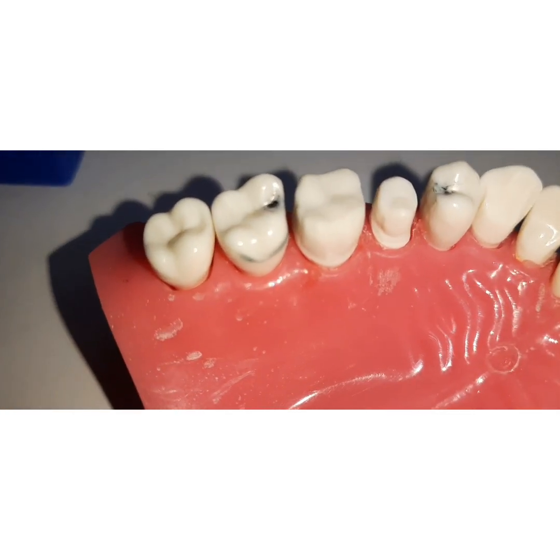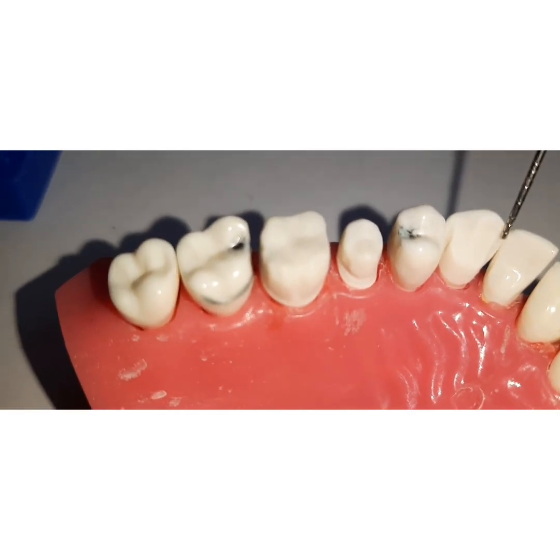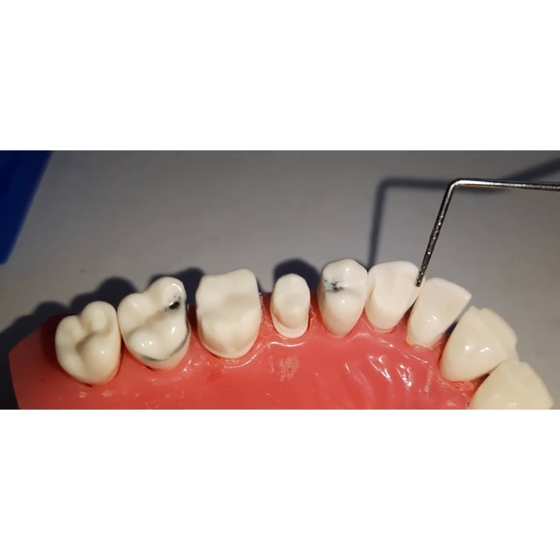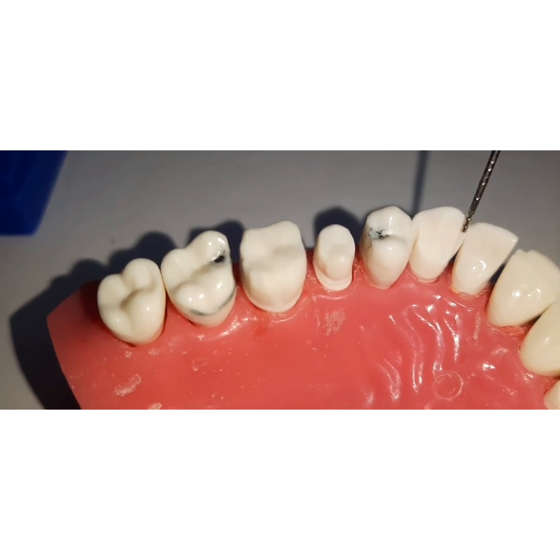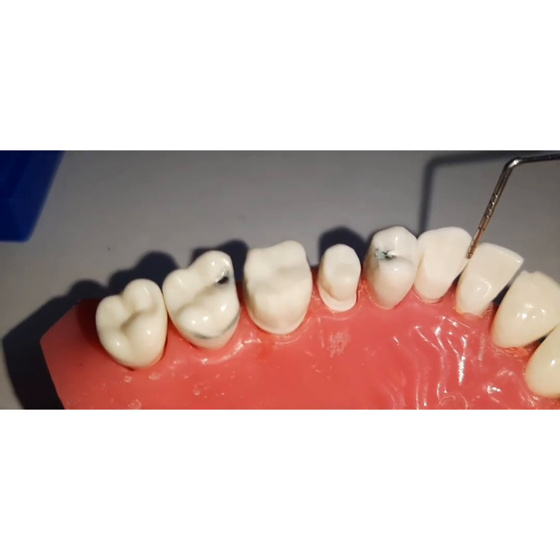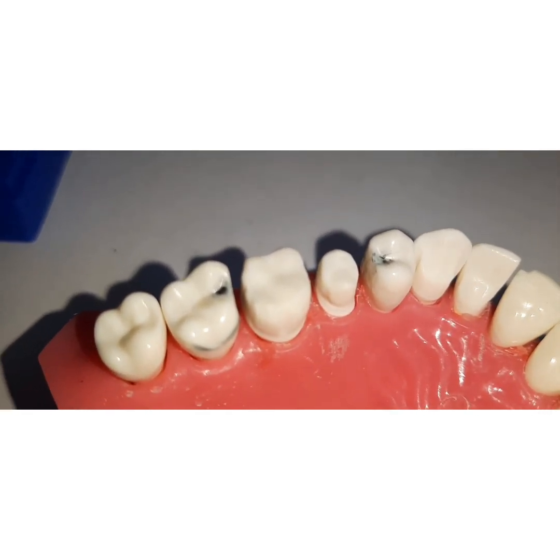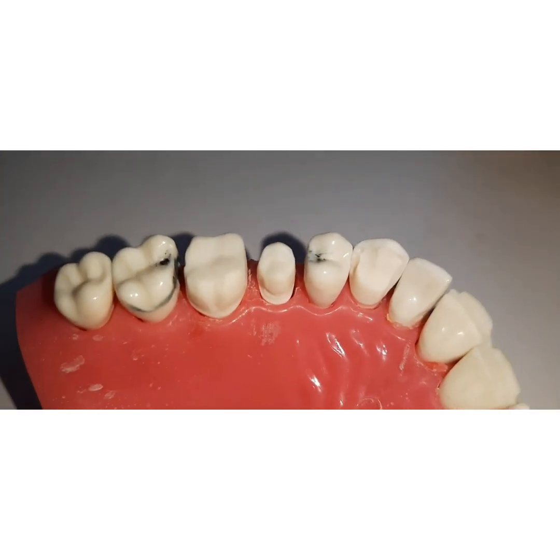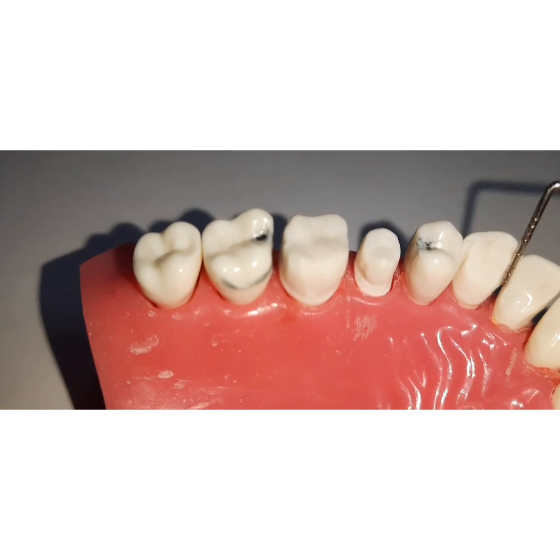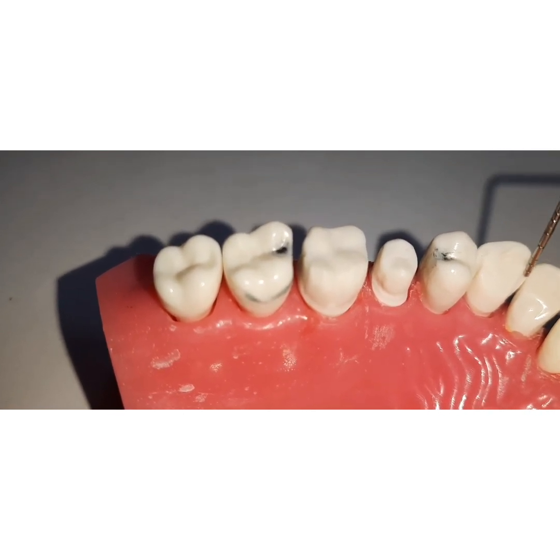Once you have made the proximal grooves on both sides, the next important feature is the proximal flare. Only on the incisal edge, extend the bur more towards the midline on both sides to give a flare. Using the same number 170L bur, tilt it towards the midline to give a flare in the incisal edge region. You can also use a flame-shaped carbide bur to create the proximal flare.